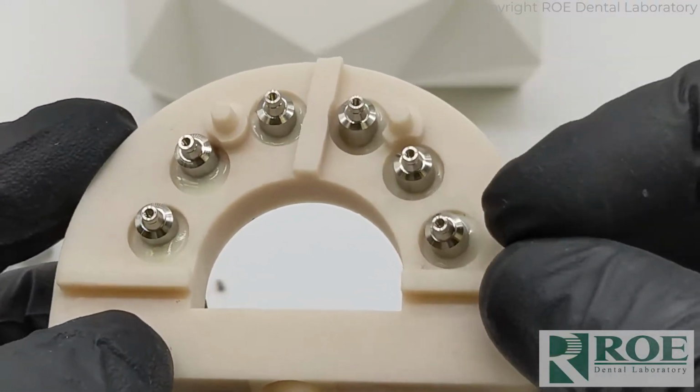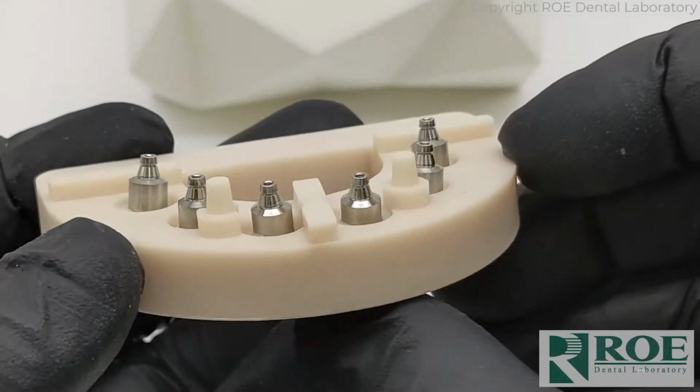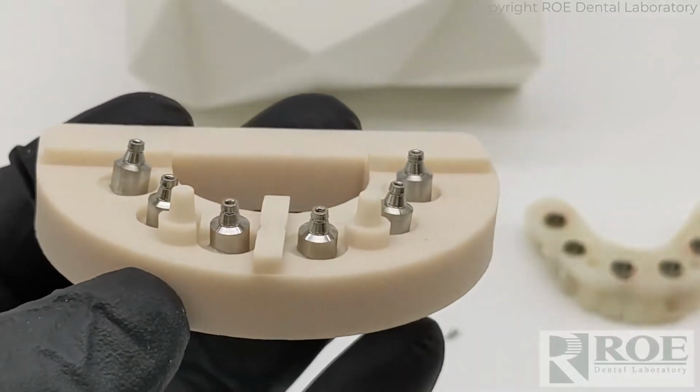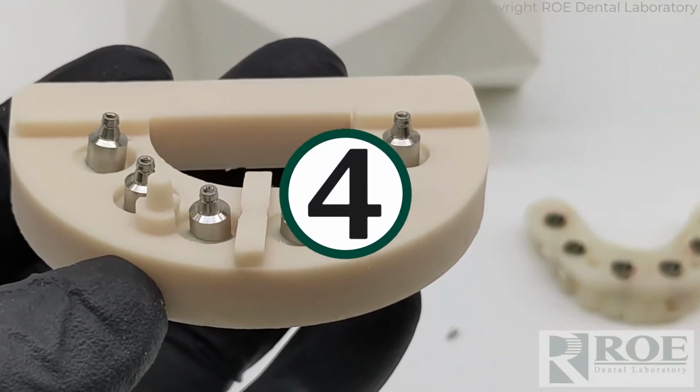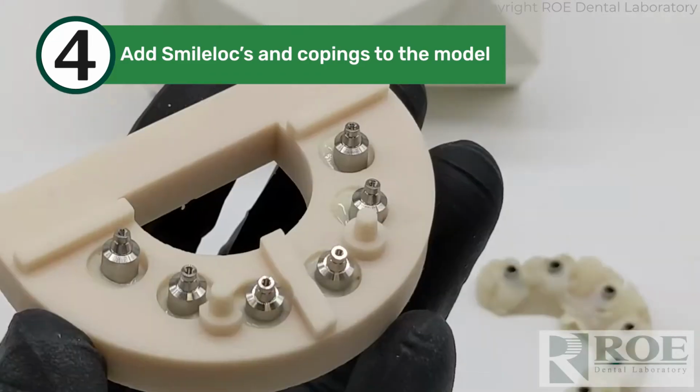See how nice and clean it is? None of the material came through and touched the prosthetic. It's just perfect. Okay, next step will be to add the Smilelocs and the copings and then do a pickup.